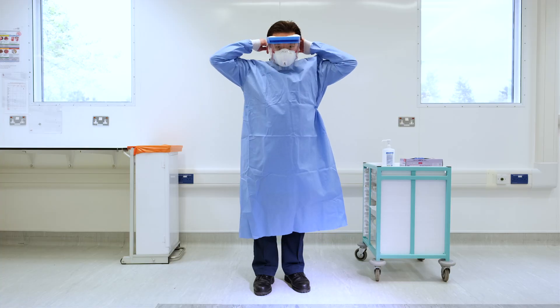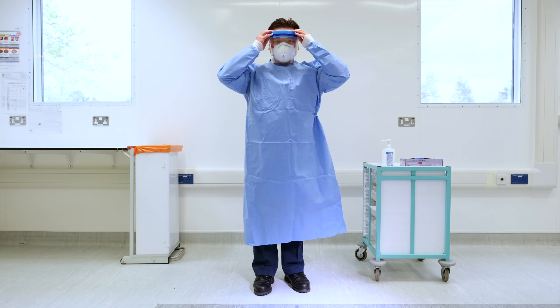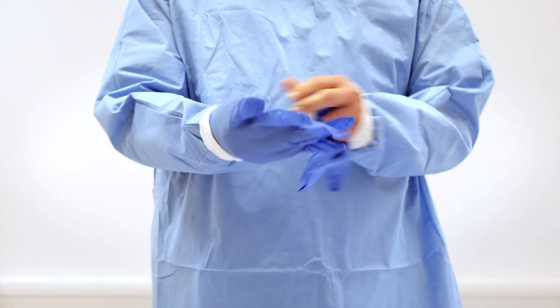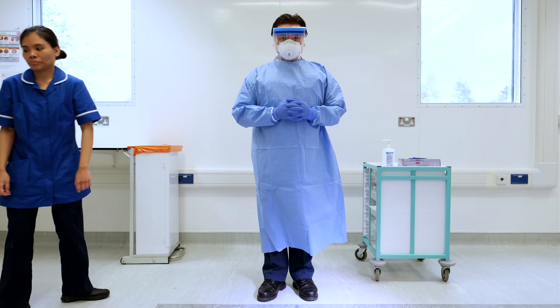Next, put on eye protection. If using the visor, ensure it fully covers your face. Lastly, put on gloves. Ensure the gloves cover the cuff of the gown. The healthcare worker is now fully donned.